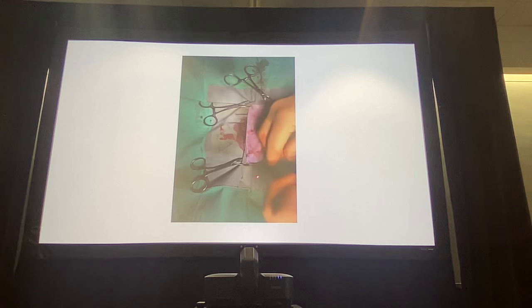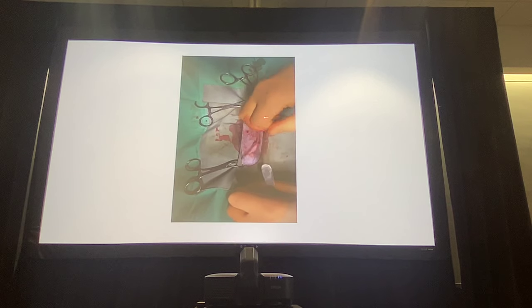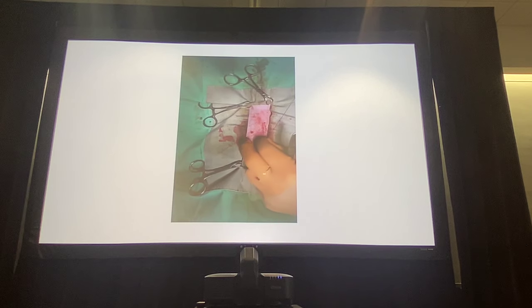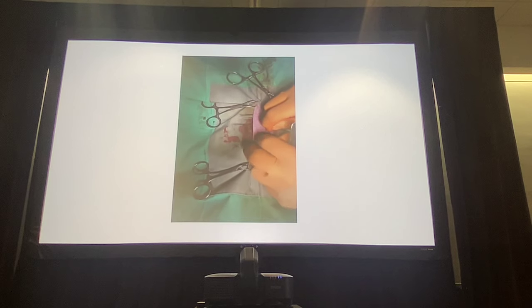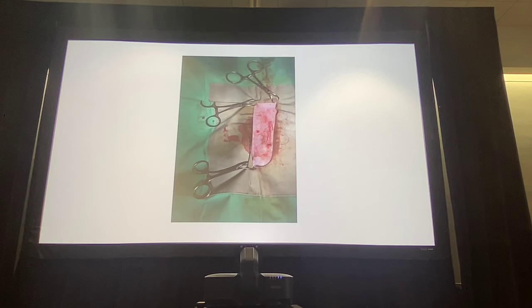Definitely this hand. Nice. And the tension you're placing here is equivalent to tightening your knots for anything else you've already done. But if you don't place tension on this side, then it's just going to be very loose for you. You're not going to be able to slip down that knot.